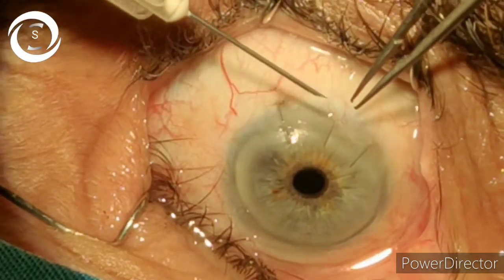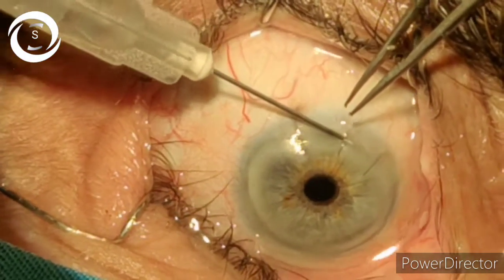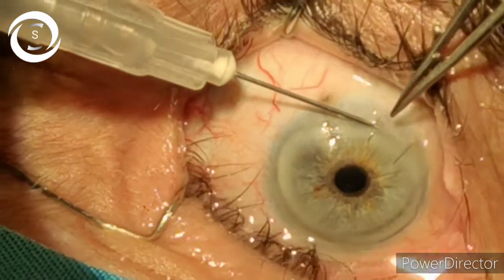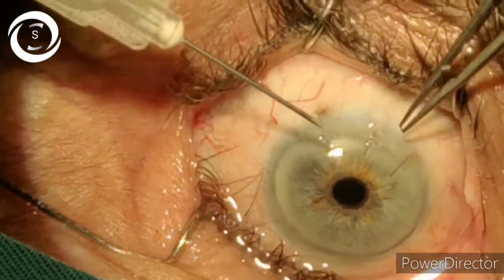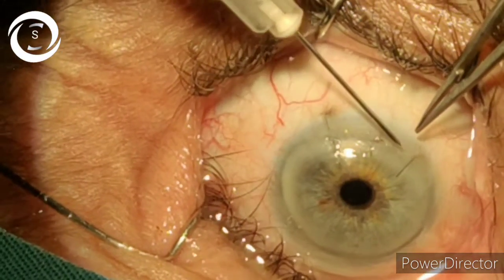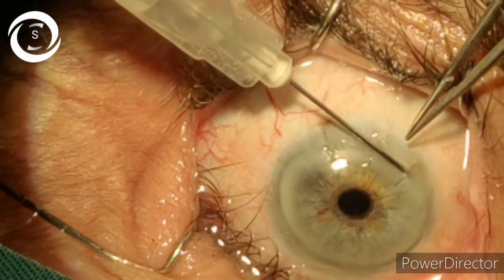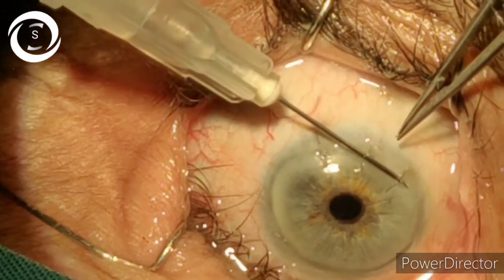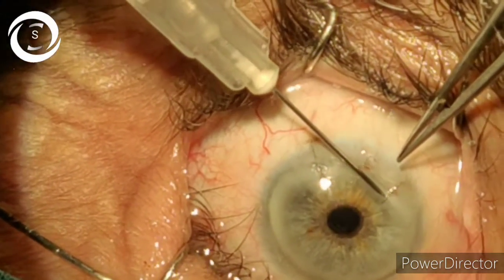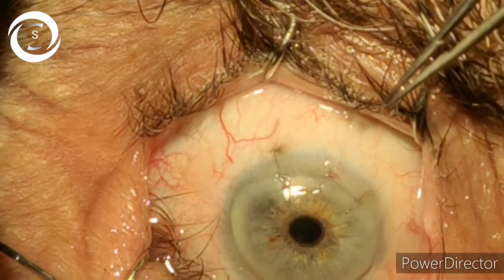The first one is cut in the center. Now again with the bevel down, go under the suture so that minimal damage to the cornea will occur. Once you elevate it, cut it in the middle and elevate the edges of the cut suture. For the third one, go under the suture, cut it, and then elevate it. We have now elevated the cut ends of all three sutures.